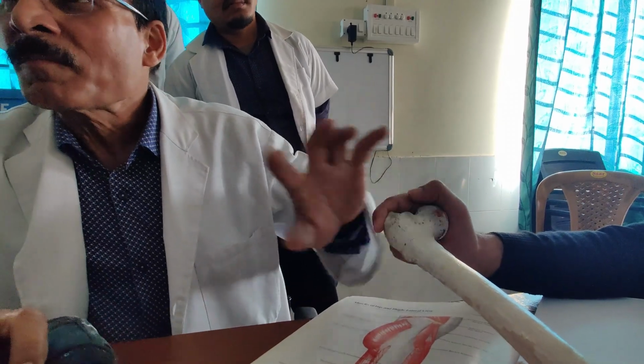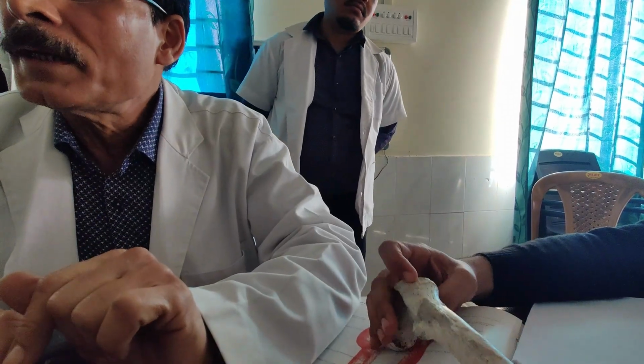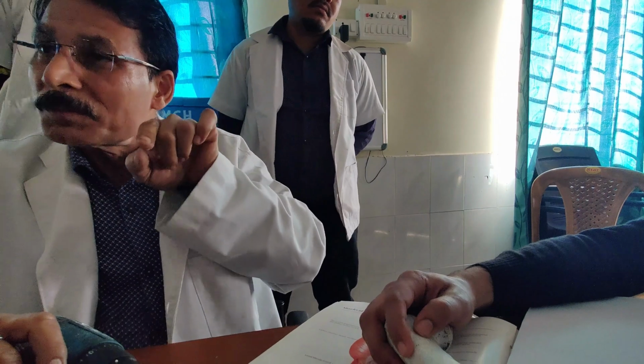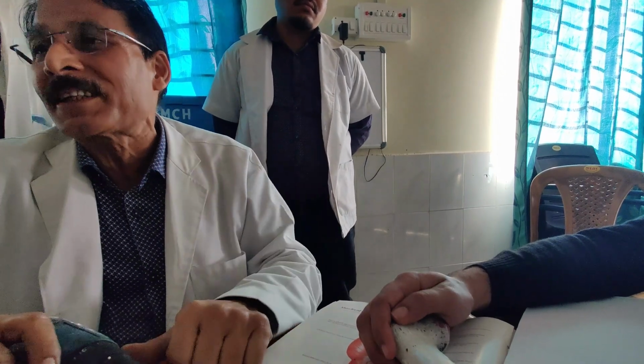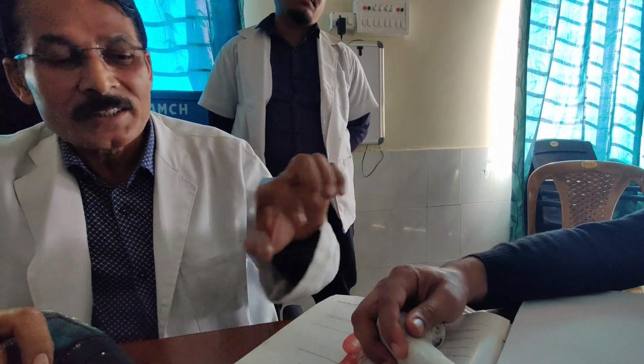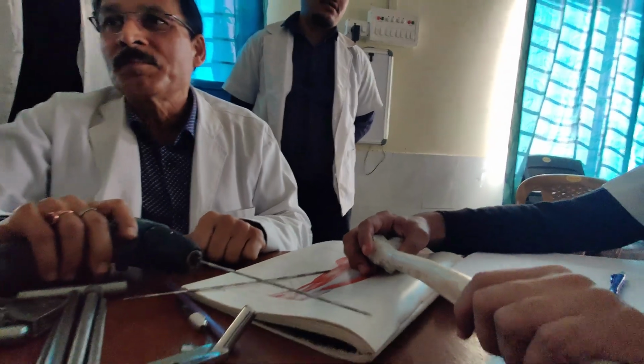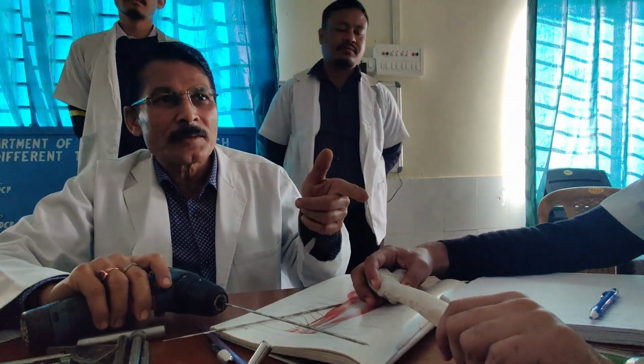First, maintain this. That is going to help you, so that the guide wire is not essentially taking any load. If there is more resistance, the guide wire may deflect. It may not stay in the same track. That is why take the help of the lateral wall to break it with your drill bit. That is essential. So do not start the guide wire.